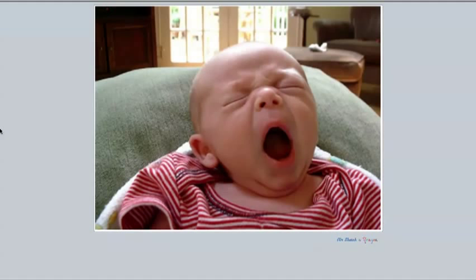Hopefully you're getting bored of this by now. I really, really want you to get so bored of flipped T waves that the next time you look at a 12 lead and see flipped T waves in the anteroseptal and inferior leads together, you just take a big yawn and say, it's a PE, go on to the next patient, right? So let's keep marching on, but I really want to drum this into your head.